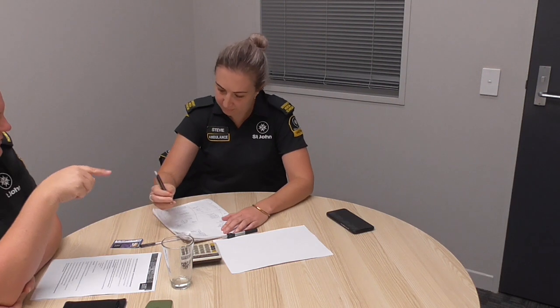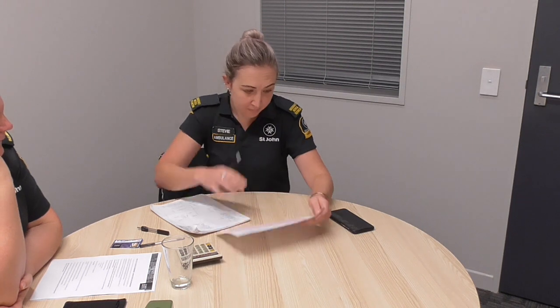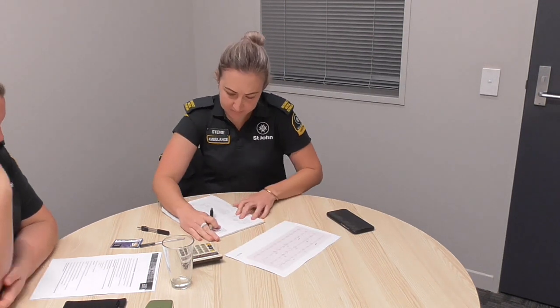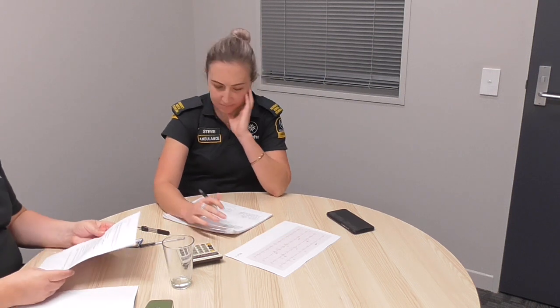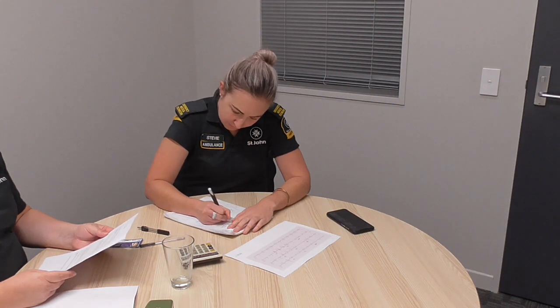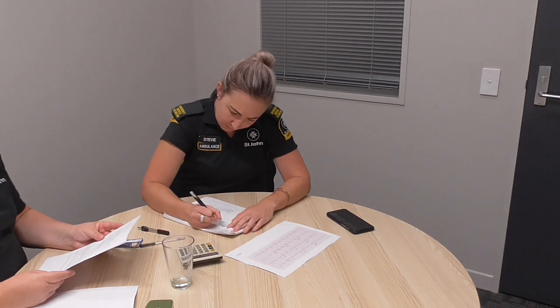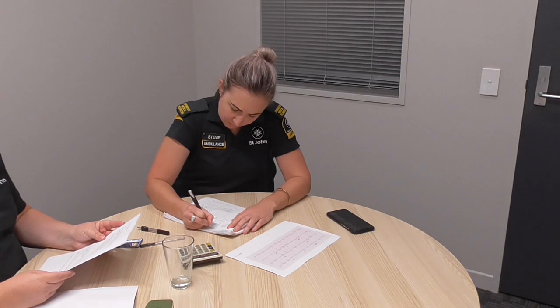Okay, so you just flip over your ECG and read out the number of the ECG. ECG 1. Great. So I'm just going to give you the scenario. You've gone to a 62-year-old male at 04:30 hours. He's woken with central chest pain, running to the jaw. The skin is warm and dry.